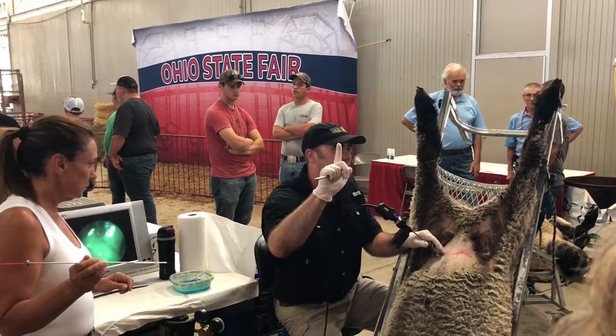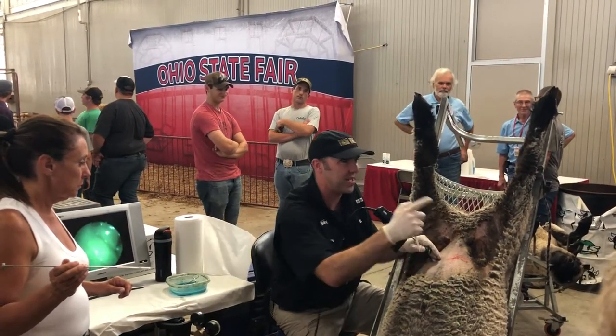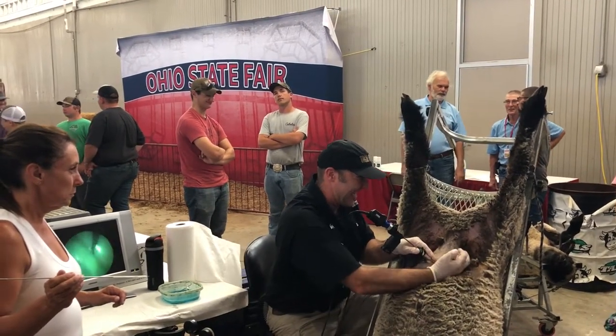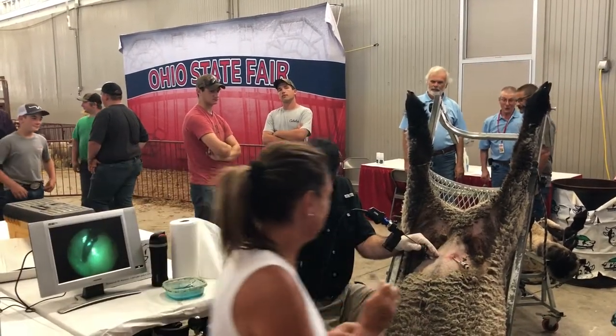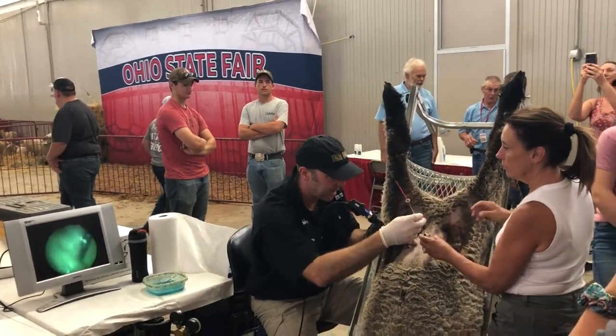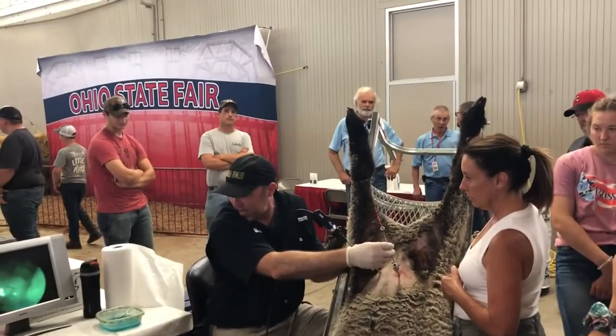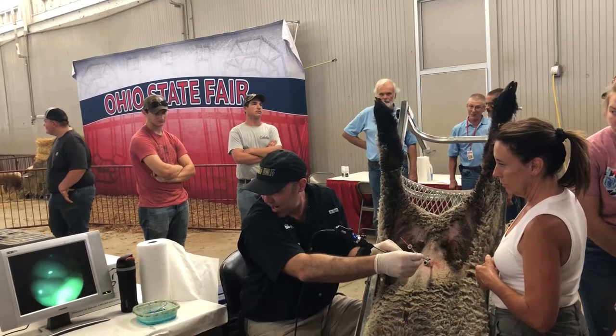Side warning — sometimes people don't like this part, but I don't put a stab incision on that just to minimize the amount of bleeding, but it does make a little pop. Some people don't like that. I'm going to go ahead and try it this way, but most likely I'm going to pop the camera off.